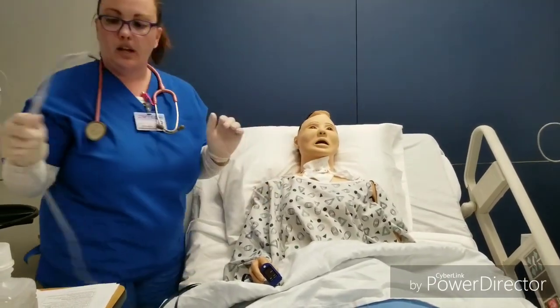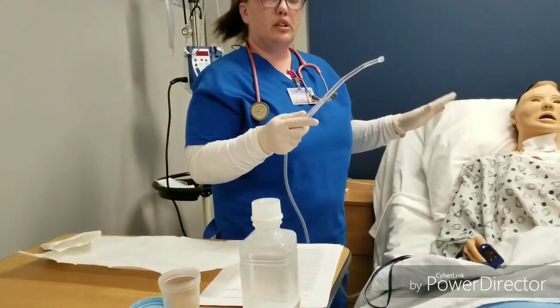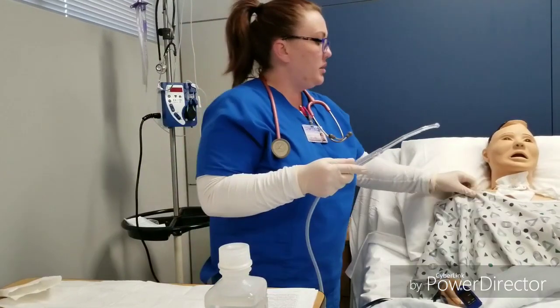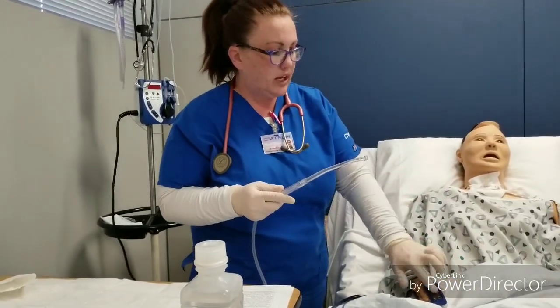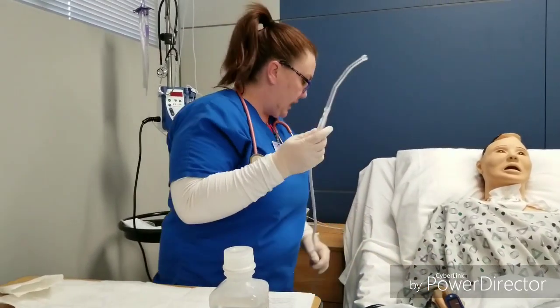Come out. Clear your tubing. Assess your patient. Make sure they're comfortable, they're breathing, they're not too anxious. And the whole time be monitoring your patient's pulse and oxygen status.